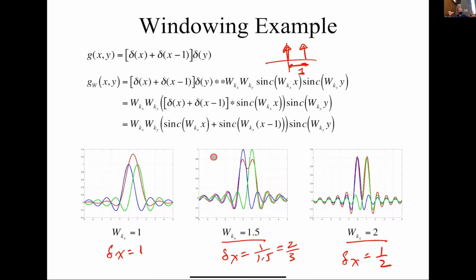What's the cost of collecting more data? Takes more time. Yeah, more time. Okay. So the drawback of more time is time equals money, right? And so, the standard has gone from, it used to be people were happy to have an MR exam of an hour per patient, right? Now the administrator's like, we want it done in 15 minutes, right? Because it's like ka-ching, ka-ching, ka-ching, right? We paid $3 million for this MRI machine. We want more scans done per hour, right? So that's one thing, okay?